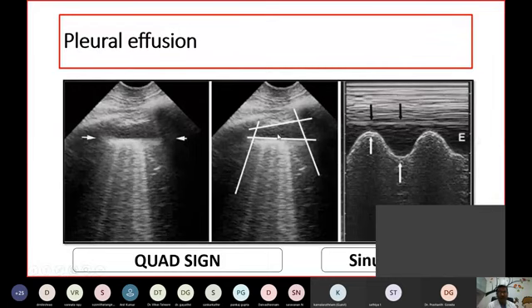Anywhere in the body, effusion will appear as anechoic. So you have to have an anechoic space, and then it should have clear-cut boundaries. Now you see the lateral boundaries are formed by the acoustic shadow of the ribs. The upper boundary is formed by the pleural line. If you remember, I told earlier, the pleural line indicates visceral pleura if both parietal and visceral pleura are in contact, and it indicates parietal pleura when they are separated.